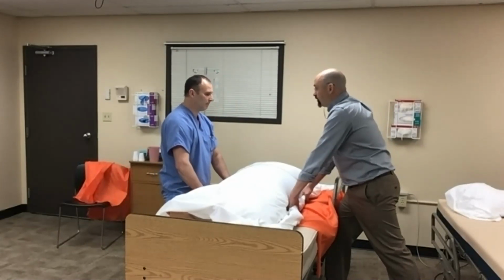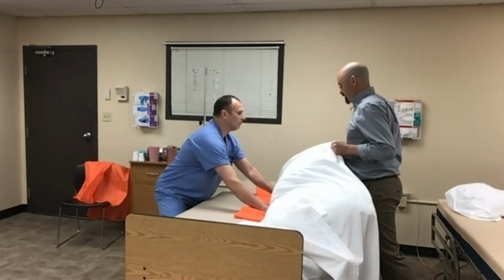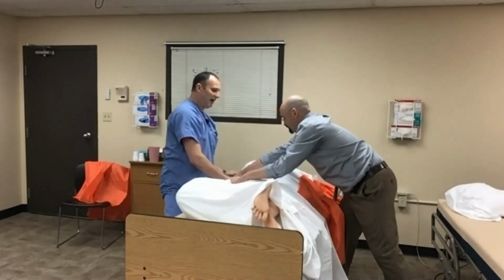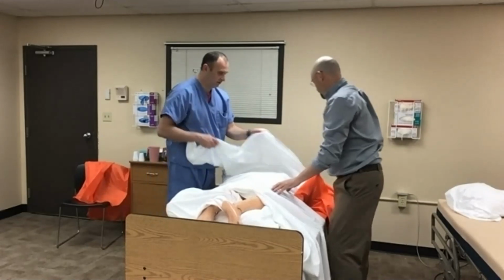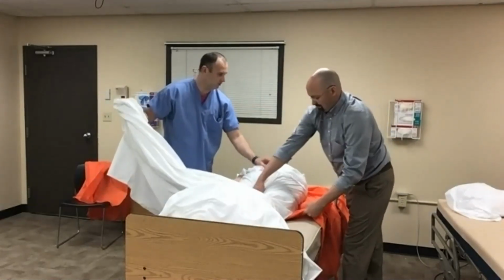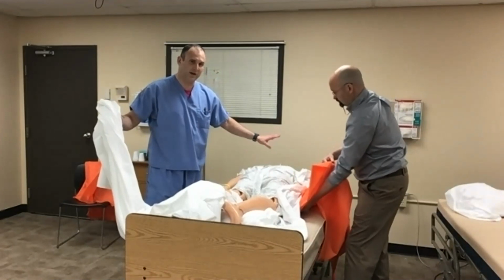On 3, we're going to go over, then up, then from. Okay. On 3 over, 1, 2, 3. 1, 2, 3 up. And 1, 2, 3 over. So that last little push I got, use the slide sheet to get the patient prone, okay? If we take this sheet off now, George is a little exposed. Poor George. You can, we've got him on the pillows pretty well, and then we can position him from there.